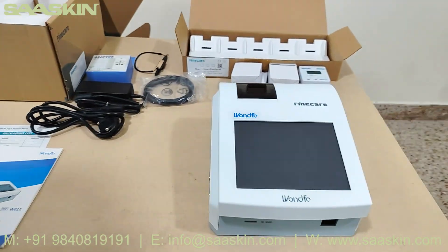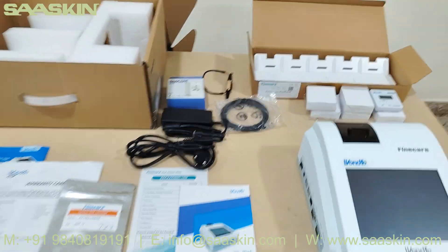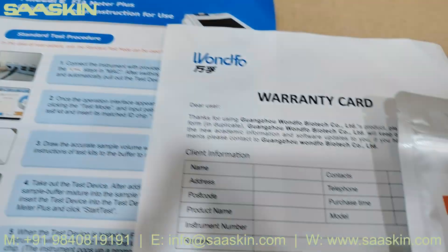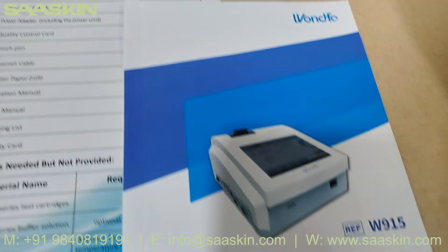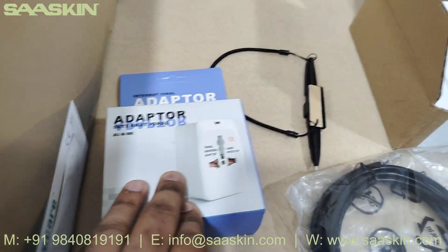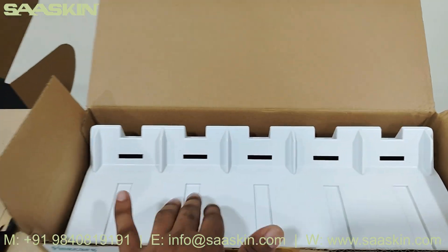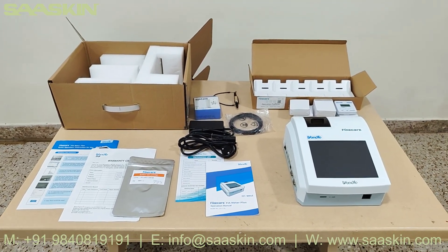So this is the Fine Care FIA Meter Plus. It comes with: quick instructions for use, warranty card, system test cartridge, packing list, user manual, power cord, power adapter, multinational adapter, stylus, ethernet cable, and the operational platform with five digital timers. Together they make the complete Fine Care FIA Plus analyzer. Thank you.